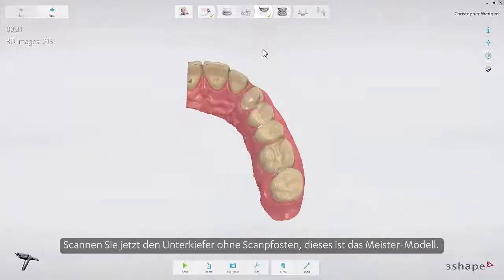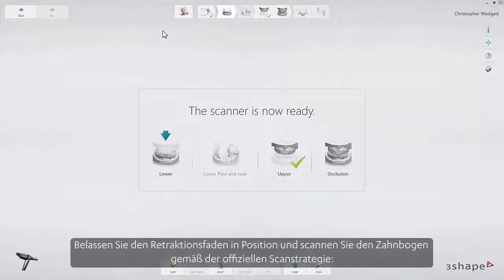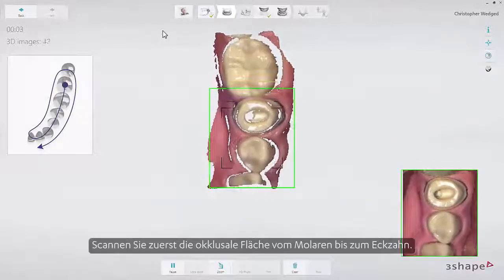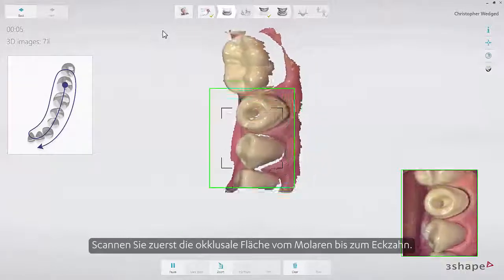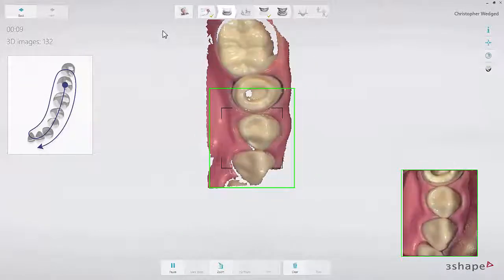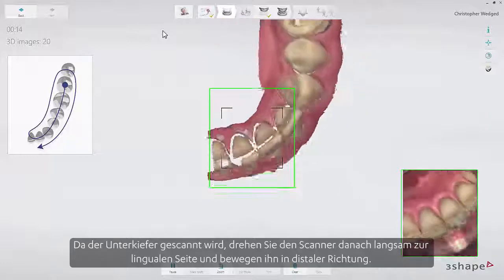Now scan the lower arch without scan posts — this is the master model. It's important to scan the same area as in the upper jaw for the best possible bite later on. Leave the retraction cord in place and scan the arch following the official scan strategy: start by scanning the occlusal surface from the molar to the canine.